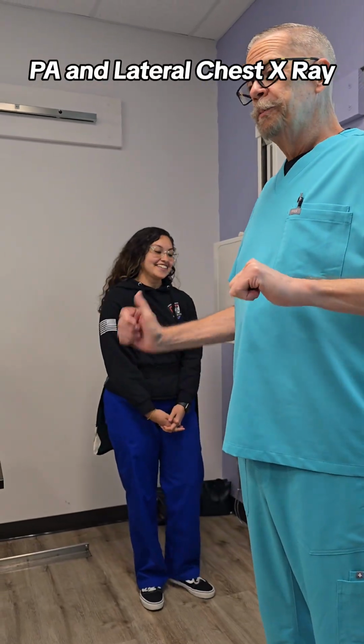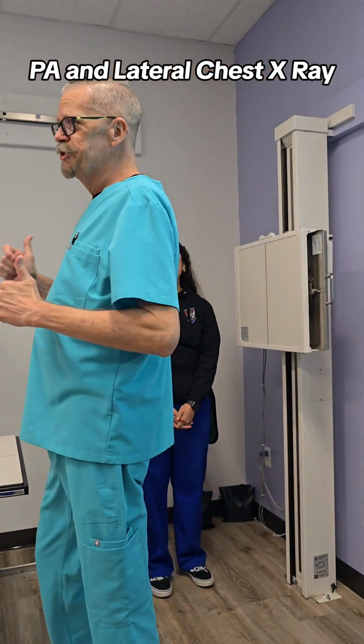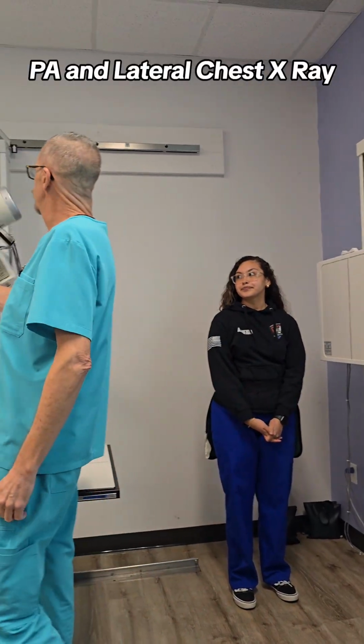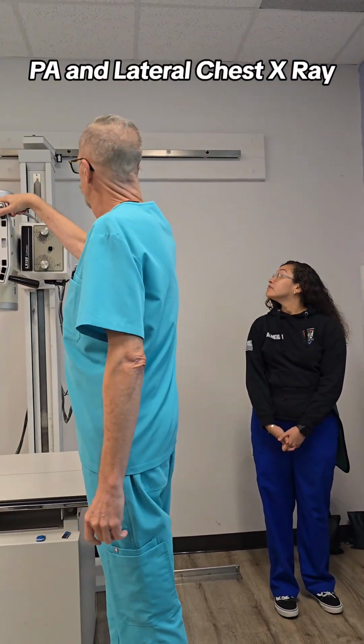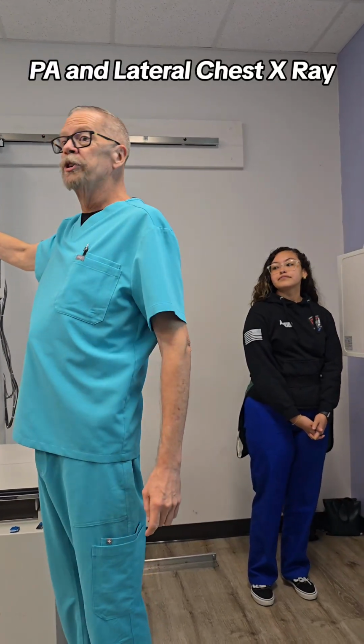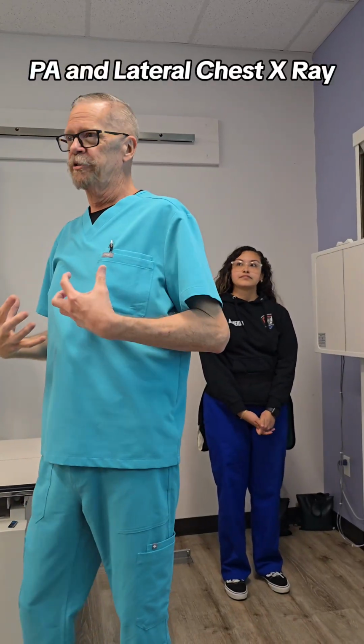Okay, so PA and lateral chest x-ray. First thing we want to do is set our SID. What should our SID be? 72. Why again 72? Because of OID, to reduce OID from the heart. We don't want the heart to be magnified.